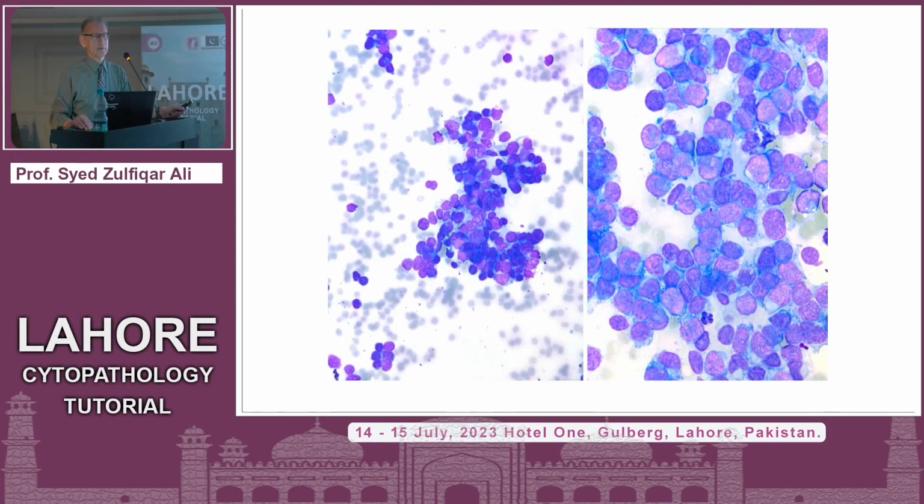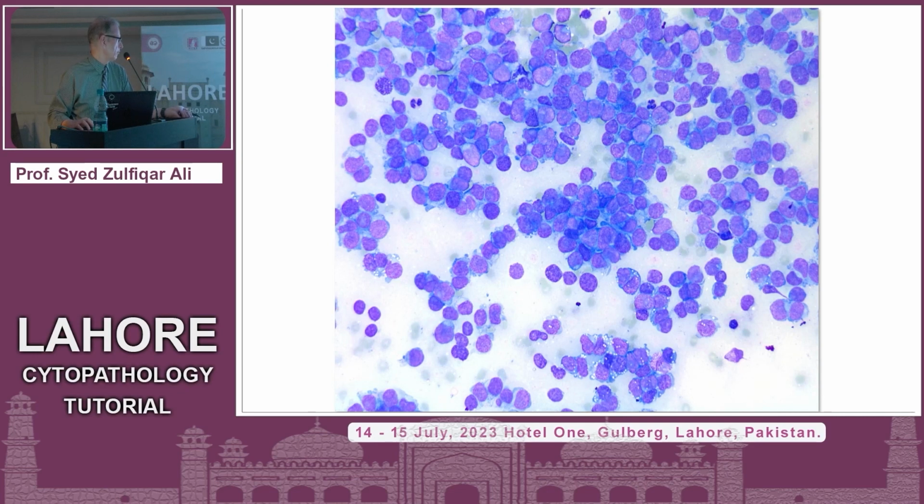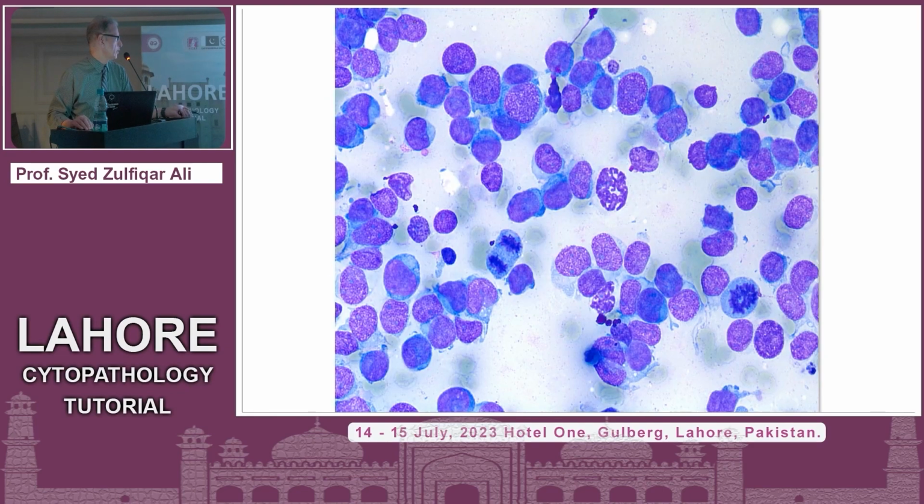So that's more appearance on DiffQuick. Slight adhesion of the cells, but we all know on DiffQuick it can happen, right? Slight rim of basophilic cytoplasm, occasional macronucleoli, for example, right there. Some suggestion of lymphoglandular bodies, but I think the first slide probably had more lymphoglandular type bodies, which are seen as a lymphoid feature. If you like to see mitotic figures, 1 and 2, possibly more, but again, a very basophilic cytoplasm. So if it's a lymphoma, it certainly would be an aggressive lymphoma.